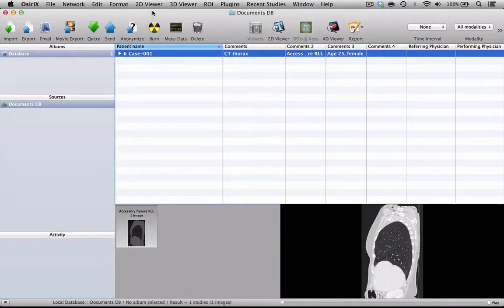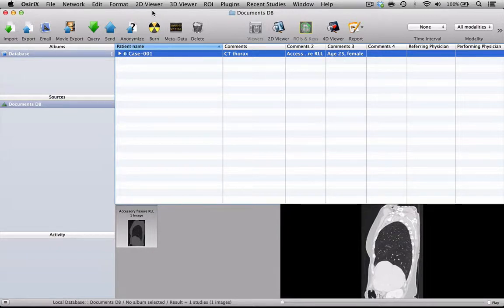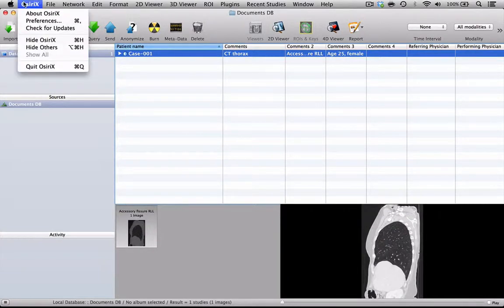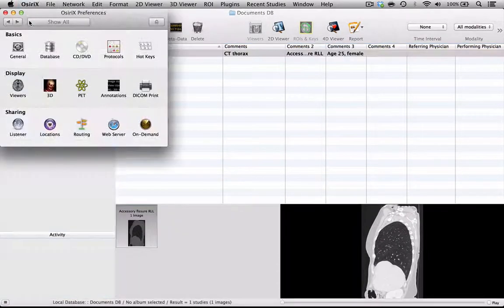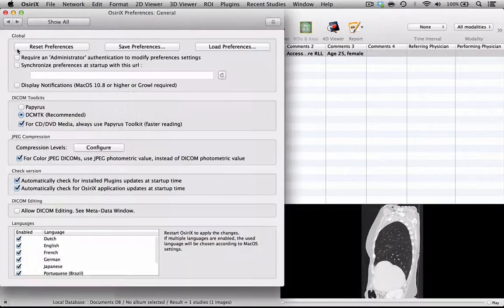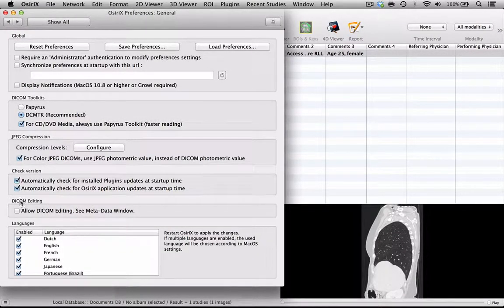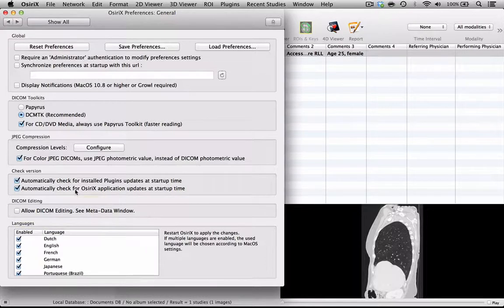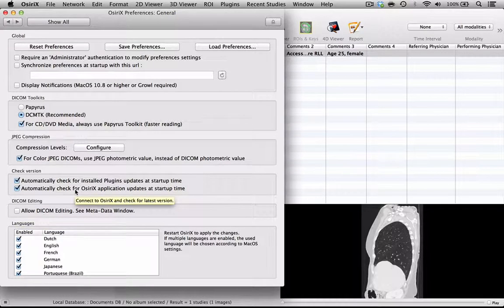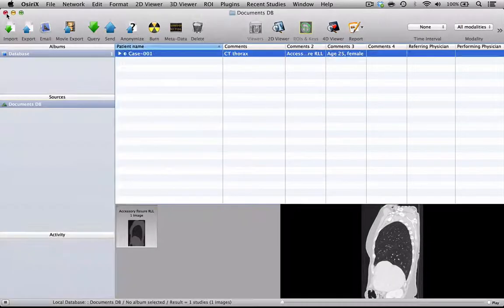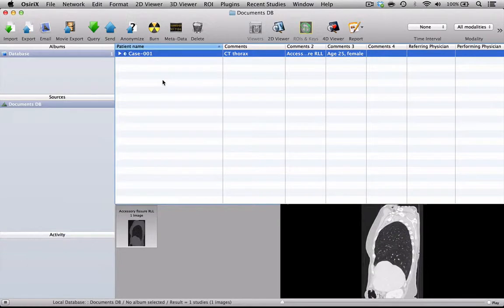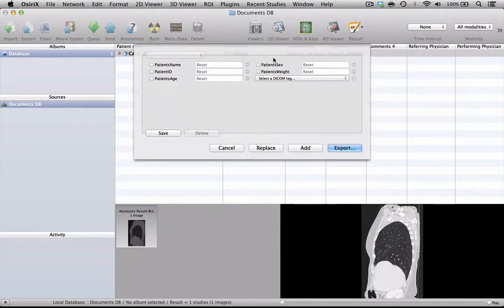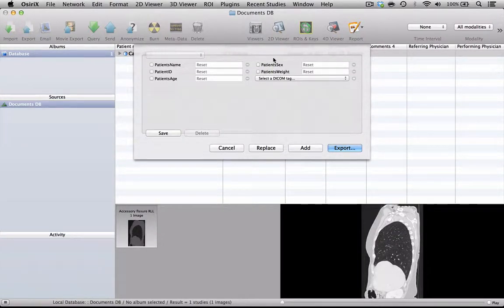If you look at how it looks once it's been downloaded from the website, there'll be certain things you'll notice. If you go into the Preferences and look at the General Preferences, you'll see that DICOM editing has not been allowed - this is the default. You'll also notice that in the Anonymization Protocols there's a very basic anonymization protocol there which wouldn't really be suitable for teaching purposes.